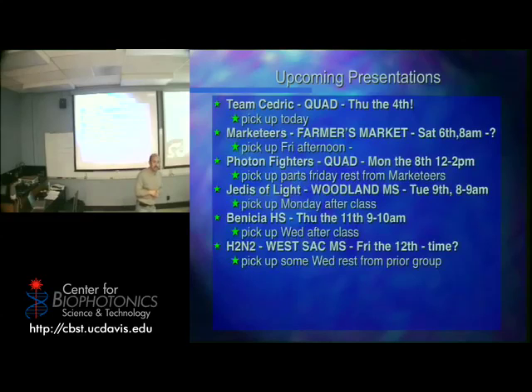Okay? Maximum? It's the maximum. Okay? Remember, for most of us, the stuff going back is at about 75%. Okay? So we're measuring the peak, and we're getting it through that heart rate. Okay? What wavelengths do we use to do this on a basic model?